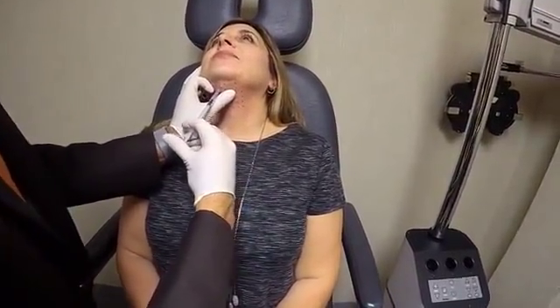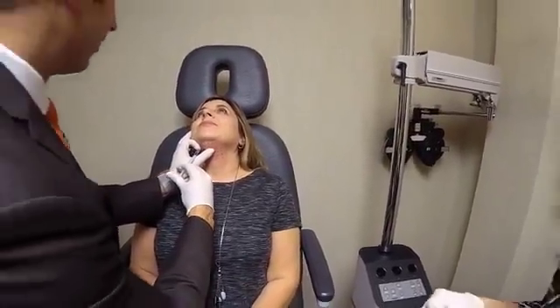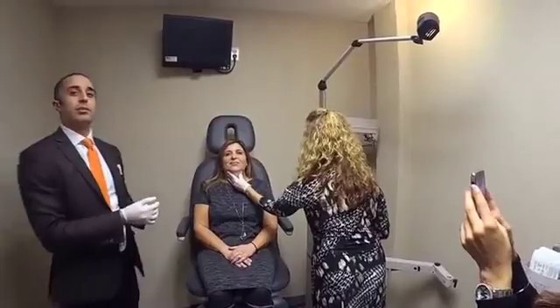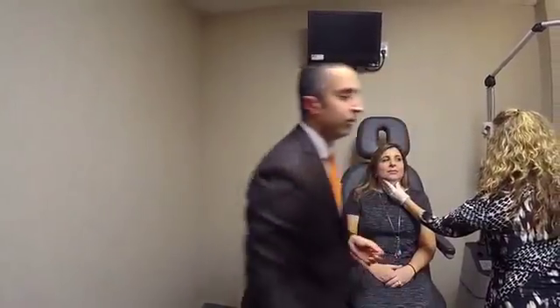After we're done, we're going to put some ice packs here. That's going to help keep down the swelling and take away that burning sensation. We want to stay away from the bone that's right underneath the chin there. There's a big nerve there that if it's struck can affect the smile. All right, awesome. So that's it when it comes to the Kybella injections. We start to see the results over the next few days to weeks as the swelling goes down, and then we can determine how many more treatments we want to do. Generally, patients will need anywhere from 2 to 4 treatments to achieve the maximum result, and the results are permanent.